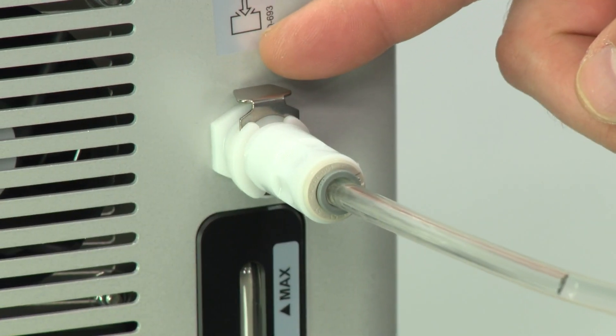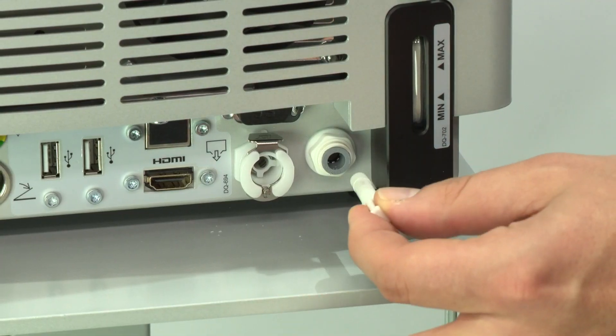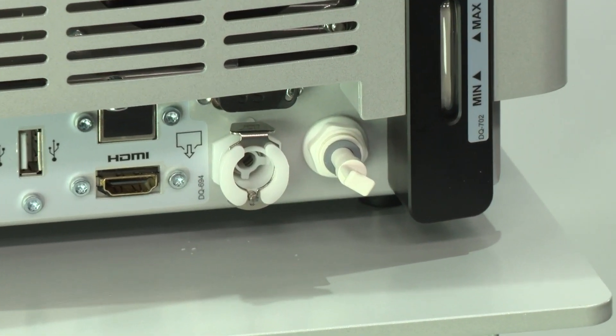Push the metal locking part down to remove the filling tube. Reinsert the air vent plug up to the stop.